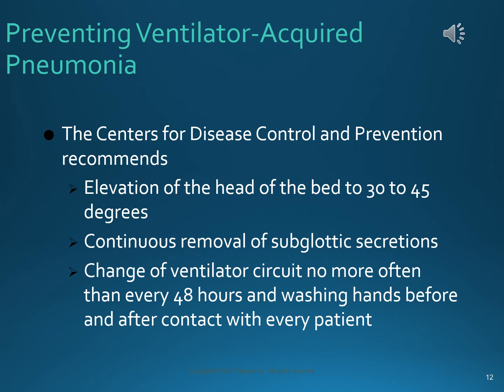This is a respiratory thing, but changing the ventilator circuit no more than every 48 hours and washing hands before and after contact with every patient. So you don't want to break that ventilator circuit if you don't have to. And of course, always washing your hands just goes without saying.